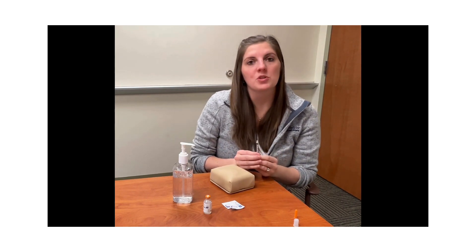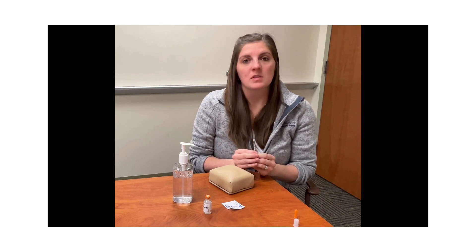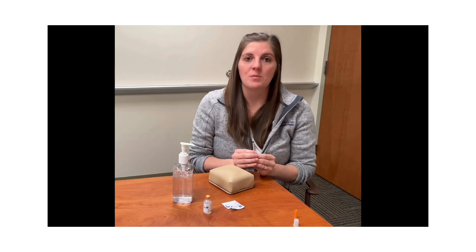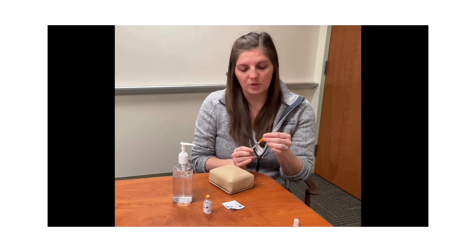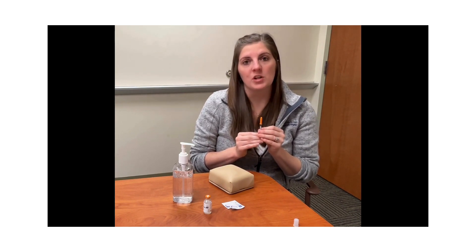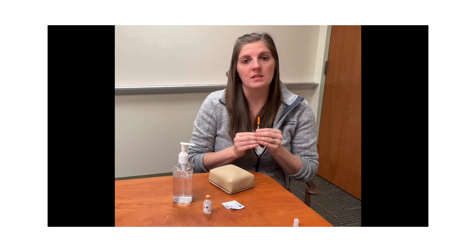At this point it is important to dispose of this in a safe sharps container and not in the regular trash. Some people do not have a sharps container at their residence, so you can at least use a plastic container with a lid that can be sealed. Since you are not always at your residence when you need to do insulin, if you are able to safely recap your syringe with the orange cap, do so as needed — knowing that once you place the orange cap it is a used syringe, and you need to put it in a safe place until you're able to dispose of it in the sharps container.